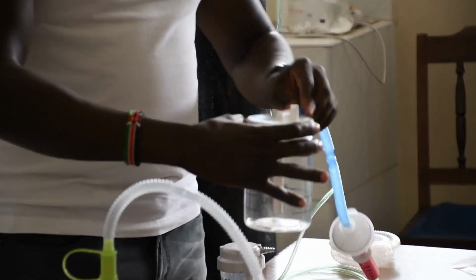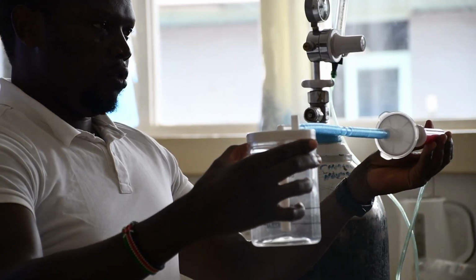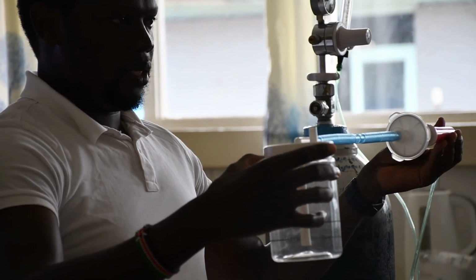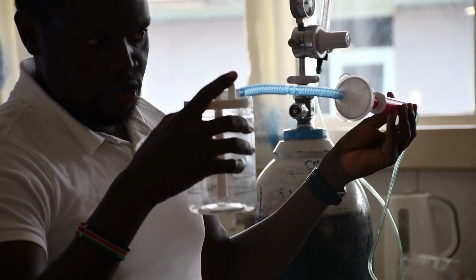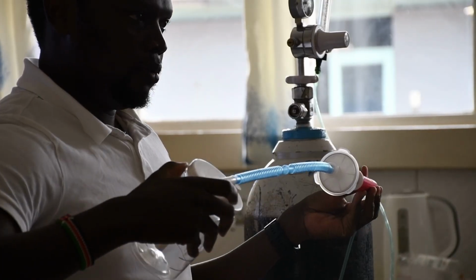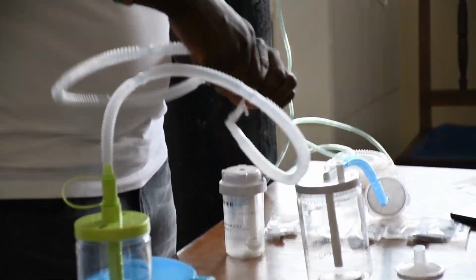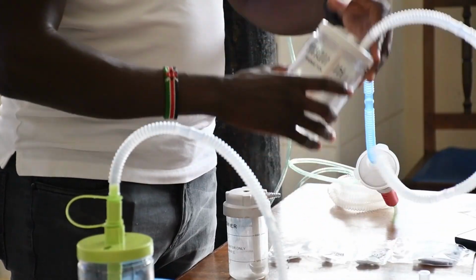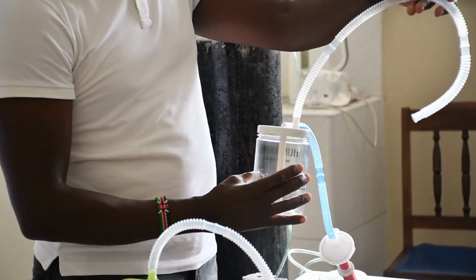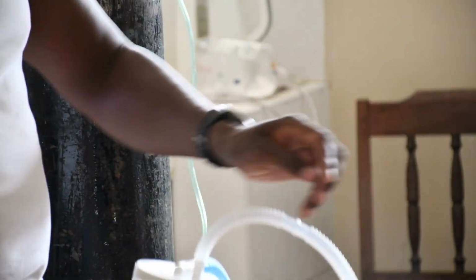So this comes in there. Okay? So we see how the gases are flown. It's the same thing that Chol presented at the beginning. So you have the oxygen source, you have blending, filter, then now you humidify, and then now you go to the patient. So you will have your first patient tubing. Okay. So this is the inspiratory end of the system.